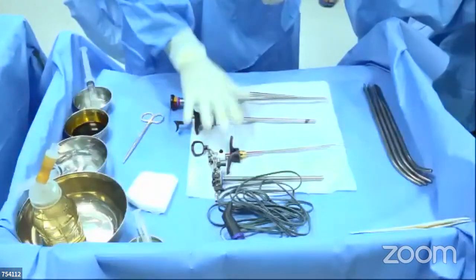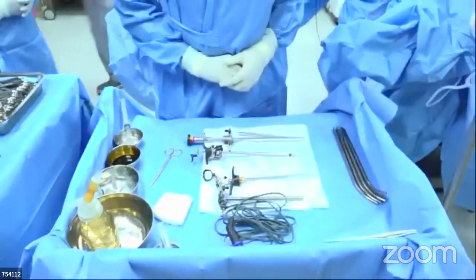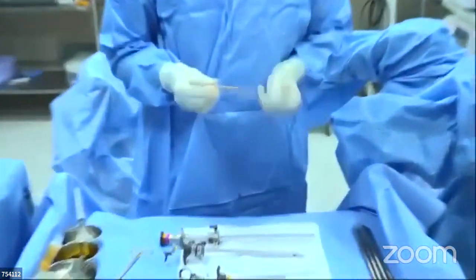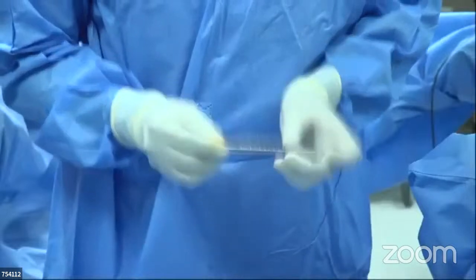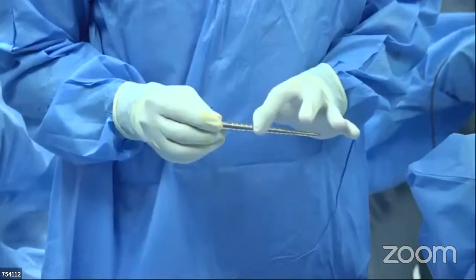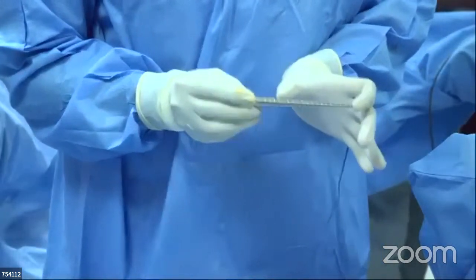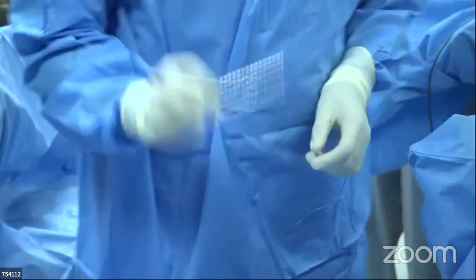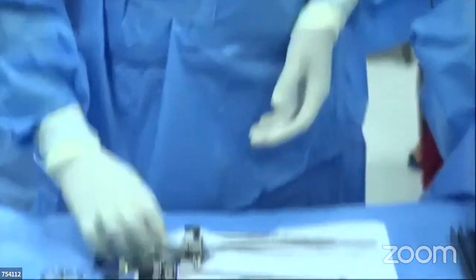That's fine. So now you're getting the external picture of the instruments we are going to use, and I'm showing the instruments and the layout of the table. One is a meatal calibrator. I don't say it is a dilator. It is a calibrator to understand the size of the meatus. Most of the time, the narrowing happens in the submeatal area, which is the narrowest area, in which case forcible dilatation will present as a submeatal stricture at a later point of time. So have a calibration. If it is less, go ahead with cutting the meatus or doing a meatotomy, rather than having a stricture at a later point of time. That's number one. Number two is the cystoscope, the usual cystoscope with a 0-degree or a 30-degree lens of your choice.